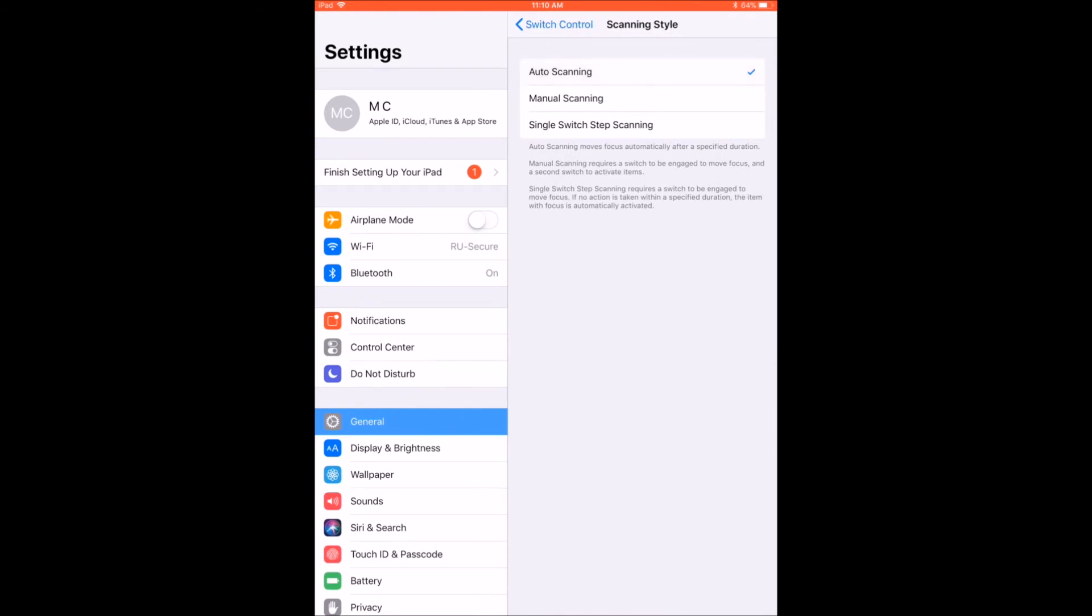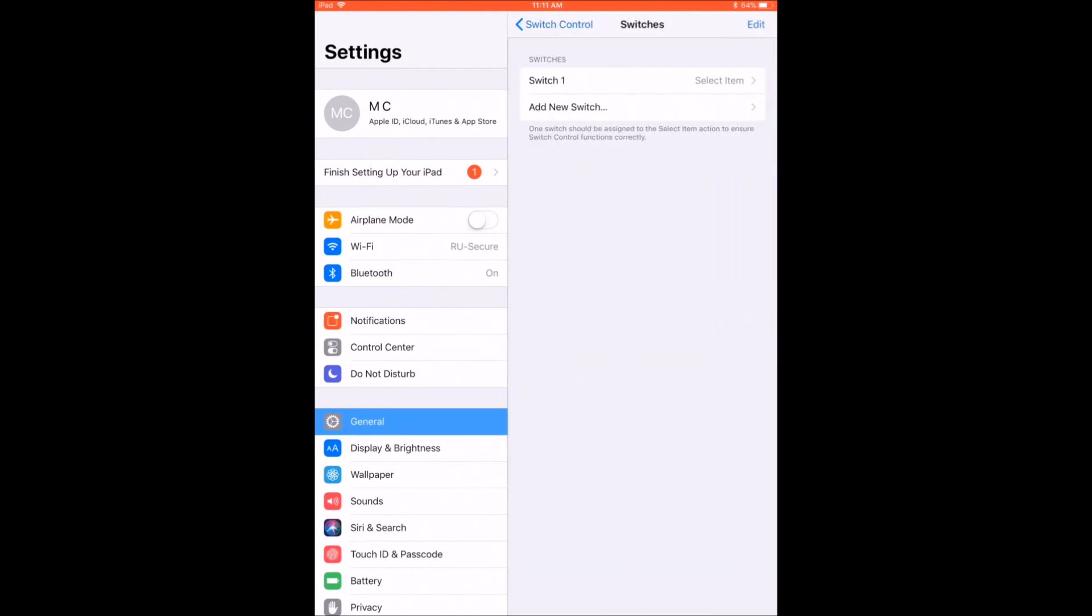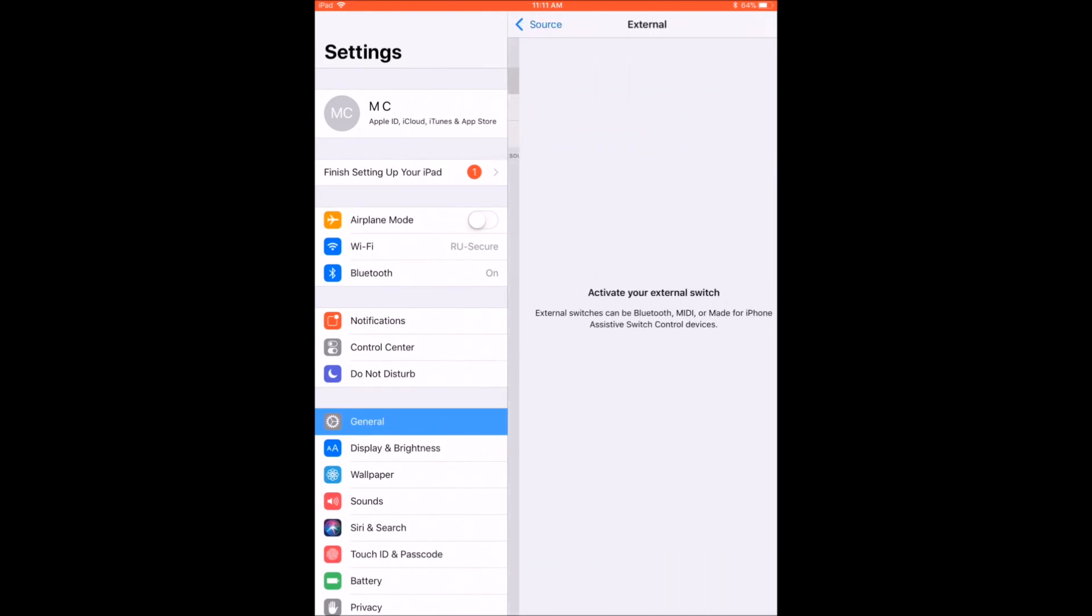If you are using more than one switch, use Select Item for your Main Switch, then repeat the steps to add a switch for all of your other switches.